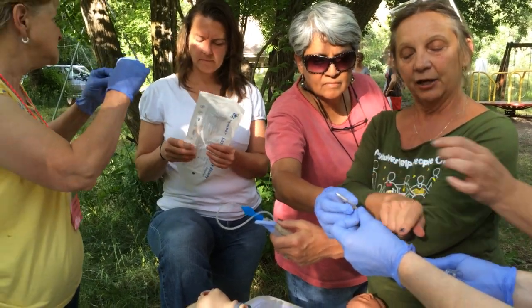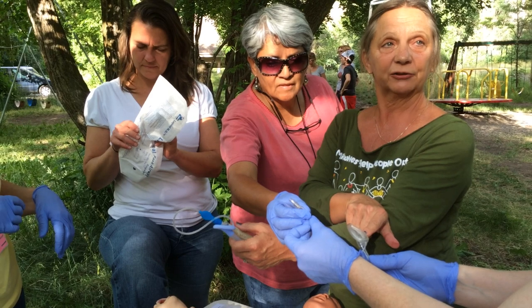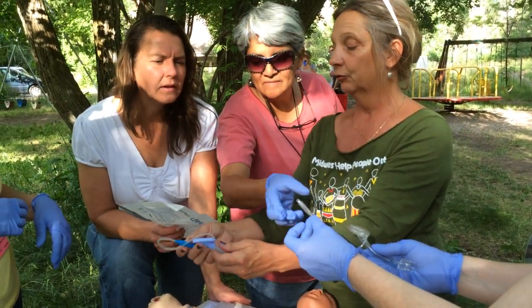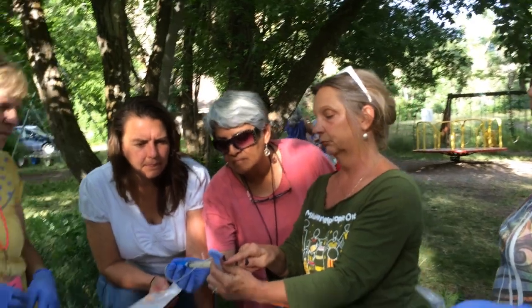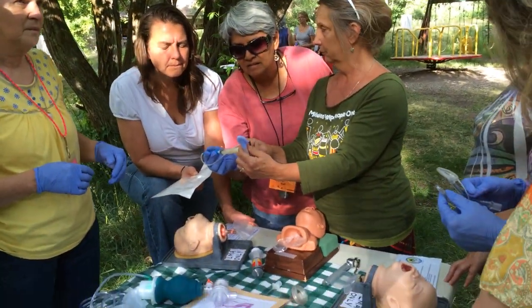Not too hard. And the other indicator is when you're playing with them. Oh, see how that's moving? You're pushing on that. You're moving that. So that is your indicator that this isn't all the way full. So you can push more air into it. That's all.